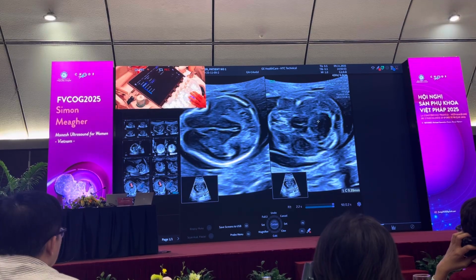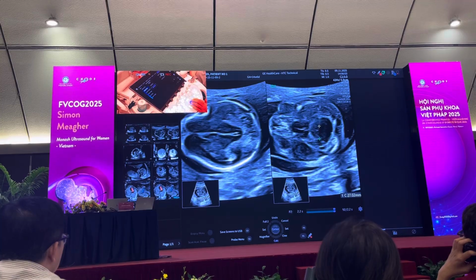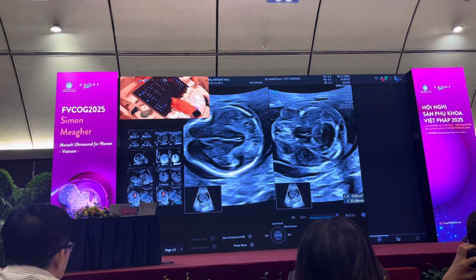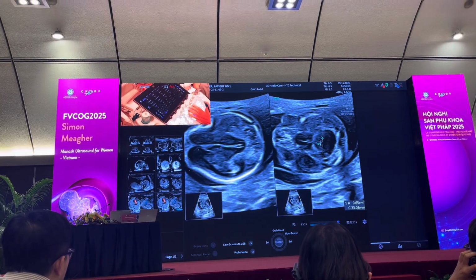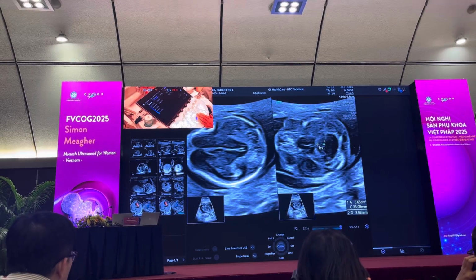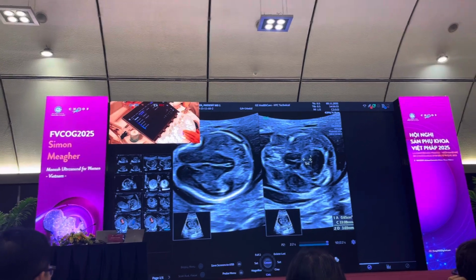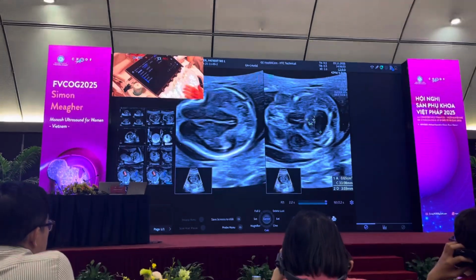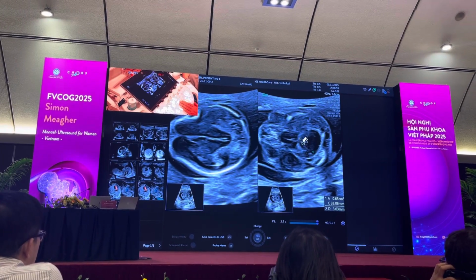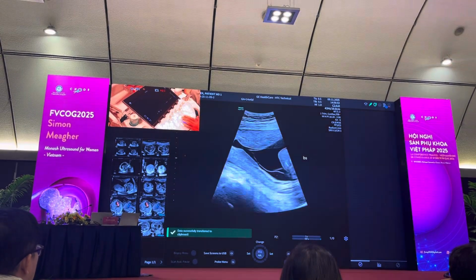So I'm going to outline for you the fourth ventricle, or the whole space of the fourth ventricle, which is dilated. And the structure that's anterior to the fourth ventricle here is the brainstem. So this is the brainstem. If you want to, you can measure the brainstem from this point here to this point here. That's the brainstem thickness. And I mentioned before that this all white area outside here is the choroid. But the important thing is that if the aqueduct of Sylvius was obliterated and the fourth ventricle is dilated, it's more likely to be a Dandy-Walker malformation. So I save that scene to the drive.